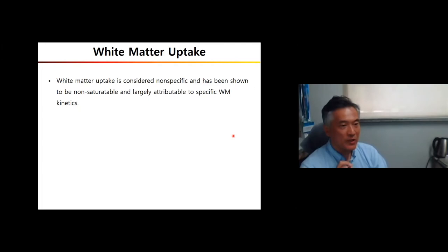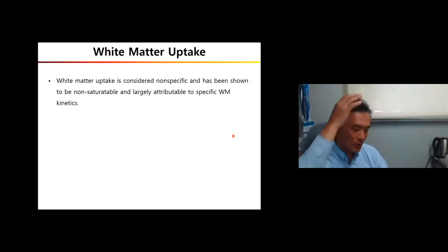But with the same radiopharmaceutical, if you wait a longer time, the white matter uptake should decrease. So if you have a limited source of radiopharmaceutical for the selection, then simply after the injection, you have to wait for a longer time.